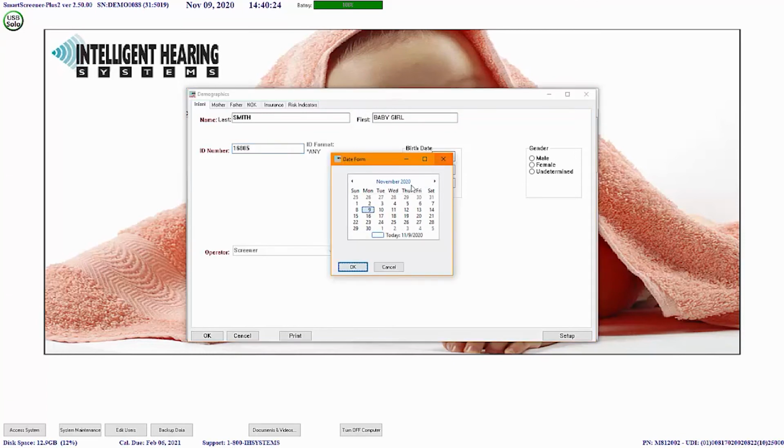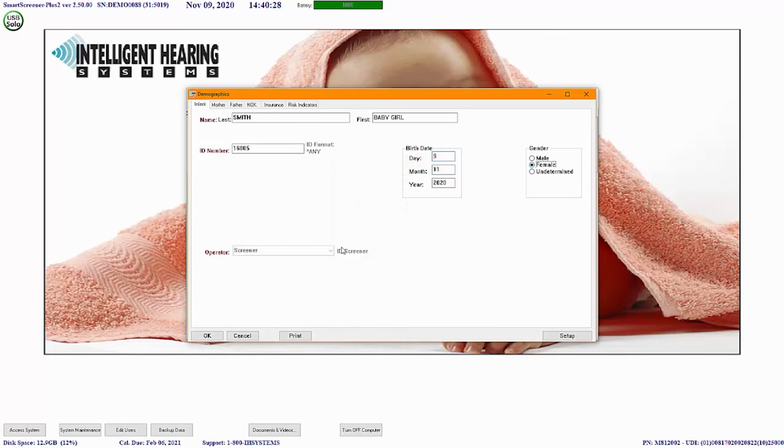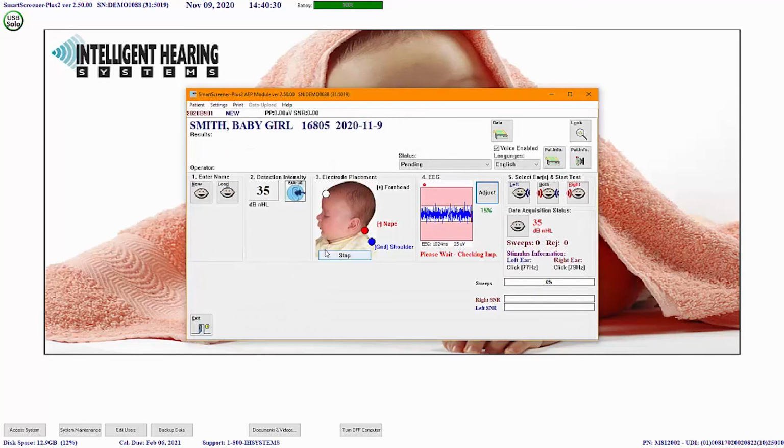Clicking on the birth date opens a calendar. Once all the patient information is entered, I will select OK, and the impedance will automatically be checked. The impedance for each electrode will be displayed next to the electrode position on the screen.